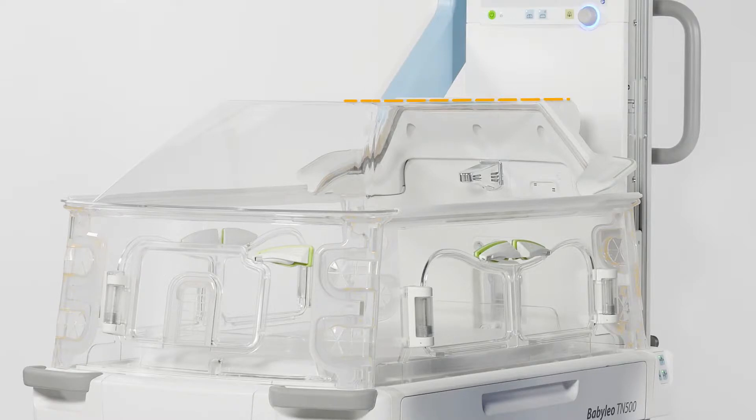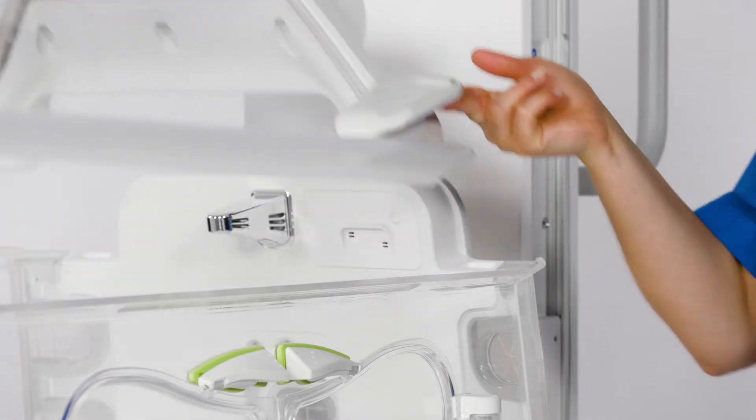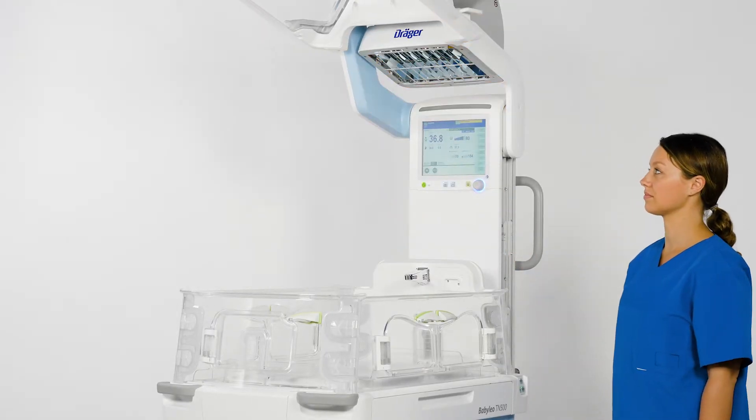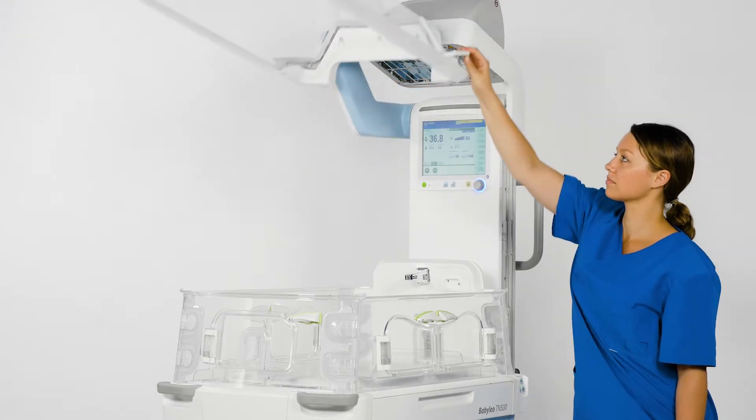Opening and closing the hood can be done manually. It is purely mechanical, so no electrical power is required. Keep in mind that when the hood is closed, it will automatically operate as an incubator. To open the hood, take hold of the handle at the side of the hood and lift it forwards and up. To close the hood, simply pull the handle at the side of the hood downwards.